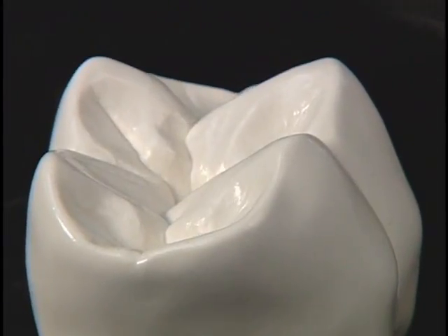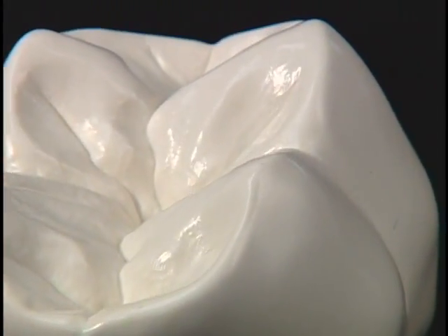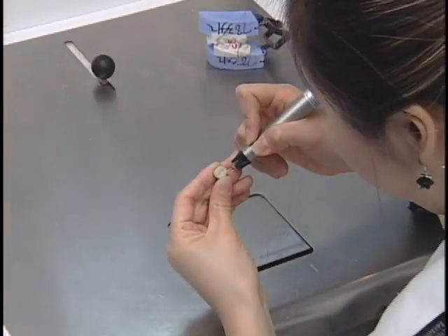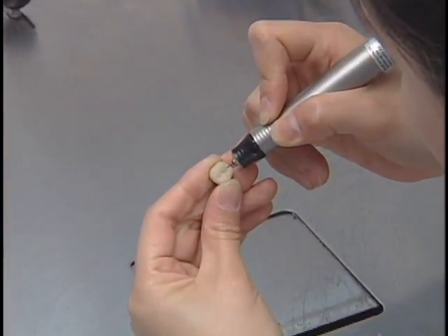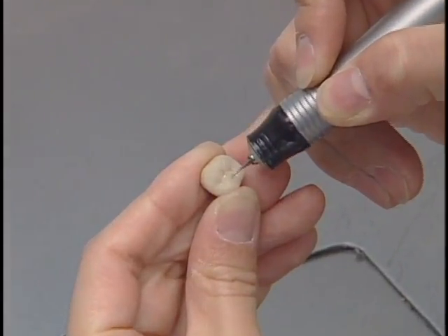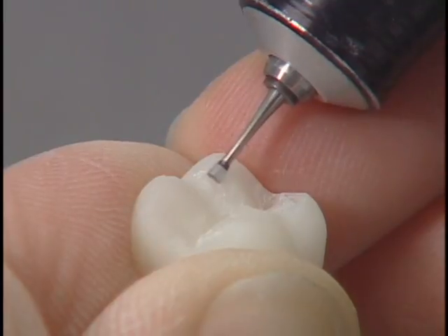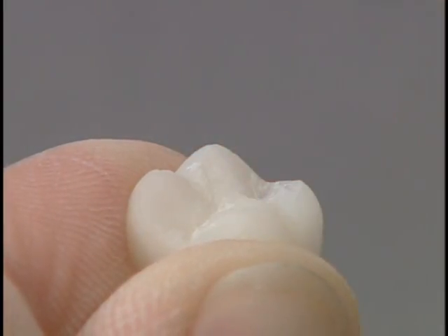Now let's talk about ridges, another important feature of occlusal surfaces and of my stylized occlusal anatomy. When we create supplemental grooves, ridges are formed too, in this case triangular ridges. We don't contour the ridges. What we really shape are the supplemental grooves, and in the process, ridges are formed.